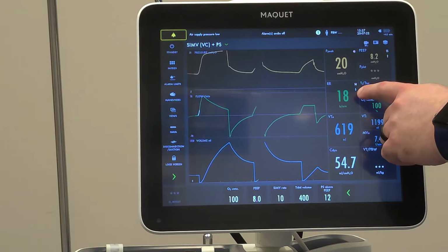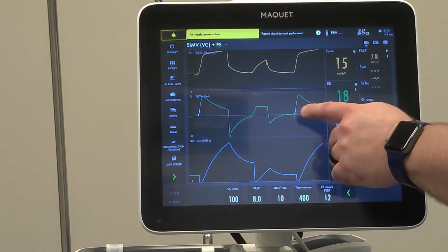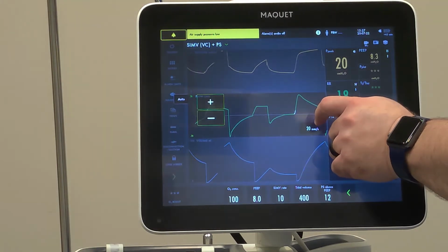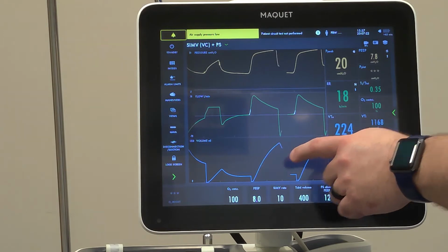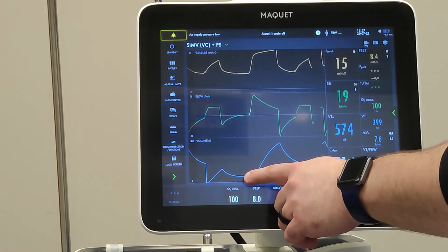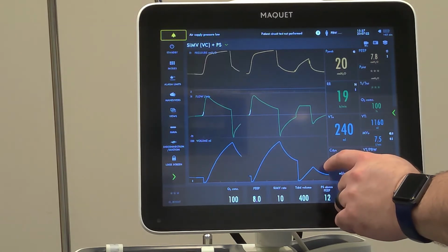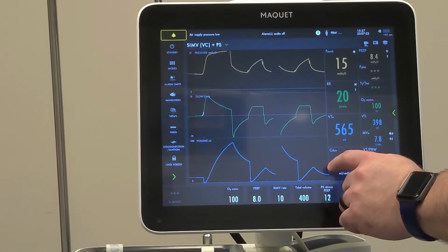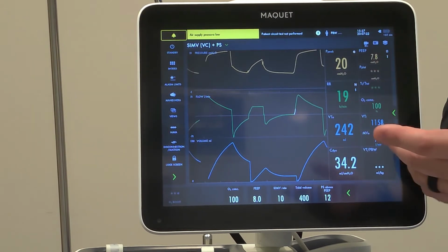We're looking at 19. So these smaller breaths are pressure supported breaths, and you can see where the white shows where the patient has triggered the breath, right? And you'll see down here on the volume waveform, these are 400, give or take, but these smaller volumes are based off the pressure support breath and are much smaller. For example, 242 versus what we're mandating.